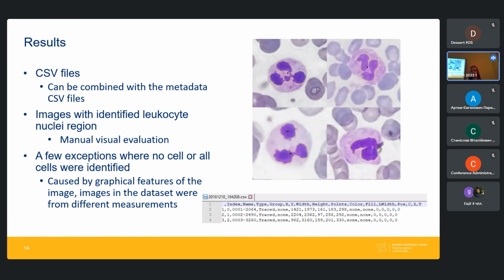Sure, but what I wanted to demonstrate in the research itself is to take a set of samples from a microscope. Imagine you have a patient and you are examining his blood. From one blood sample you get around 70 images of the blood.